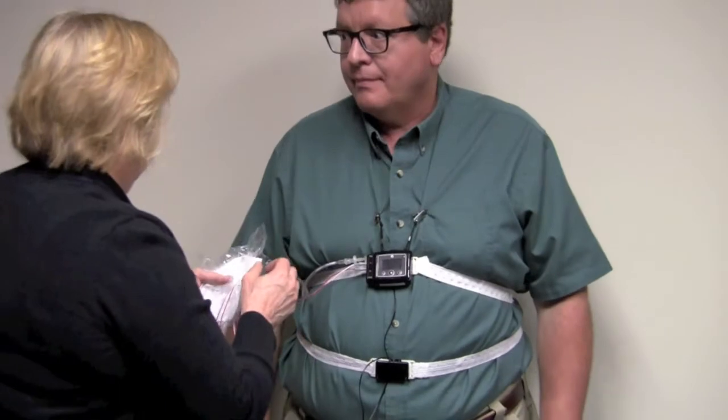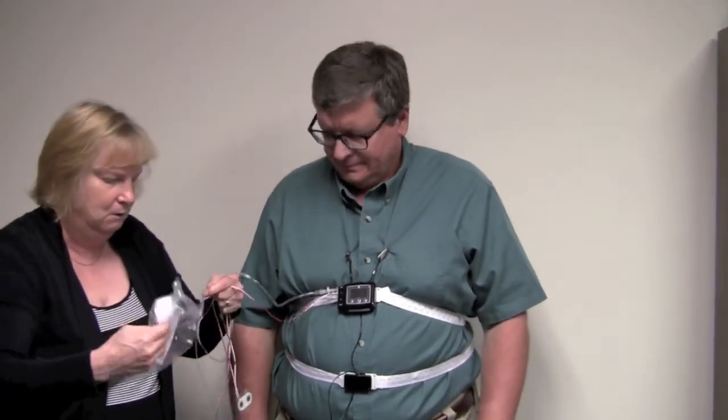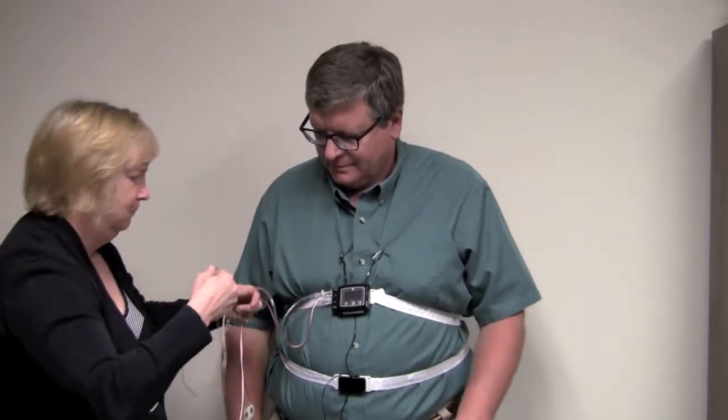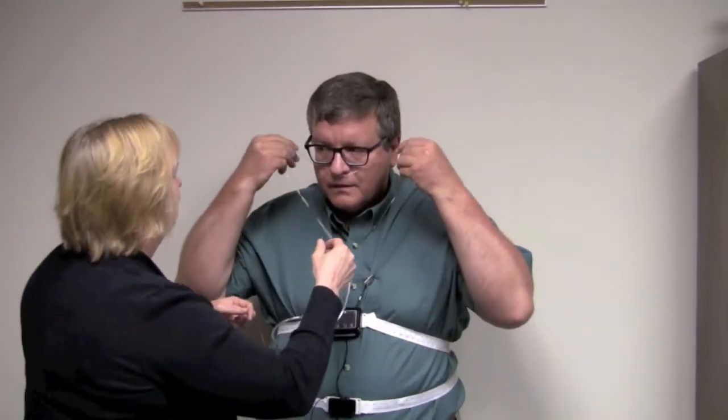The next two pieces — we're going to use the cannula for your breathing. This one is just out of the bag, just for you. To put it on, place the cannula in your nose and take the straps and wrap them around your ears. If it feels loose or like it might be sliding off, you can put two pieces of tape here to hold it in place if you feel the need.